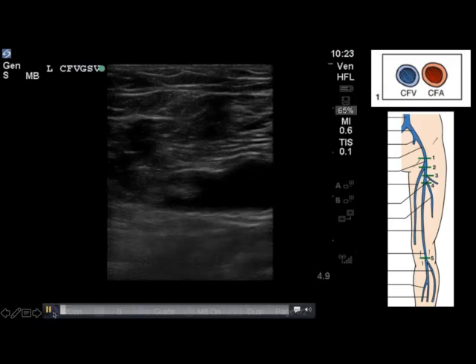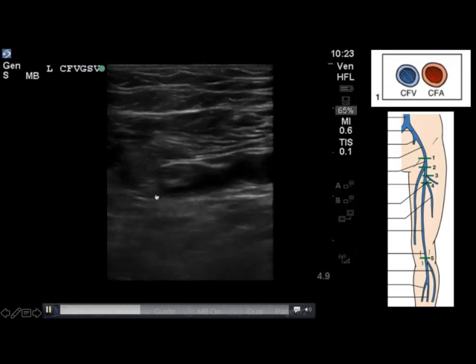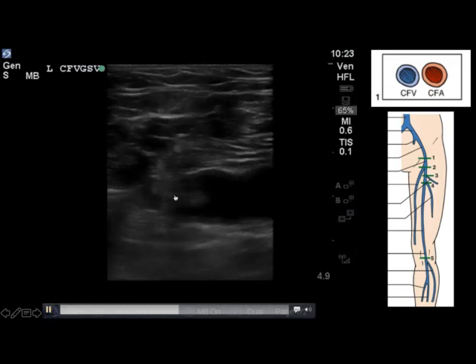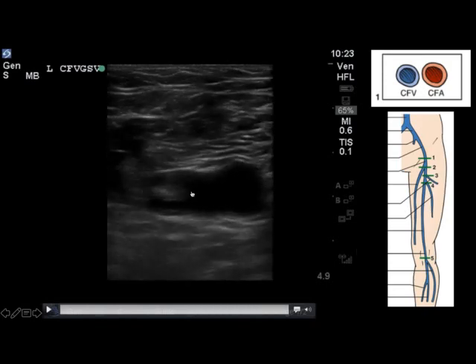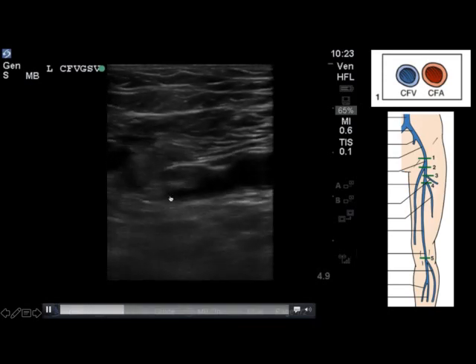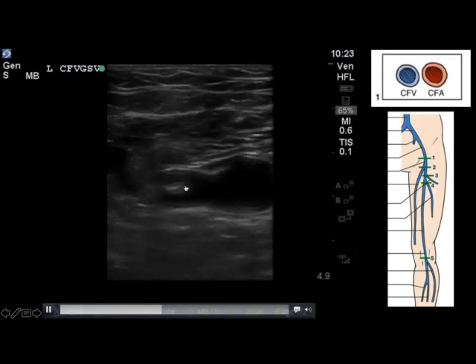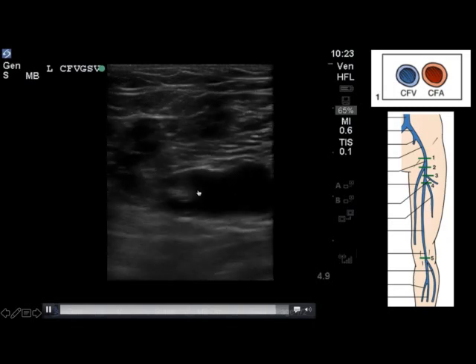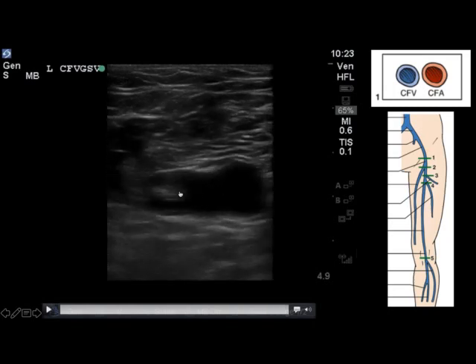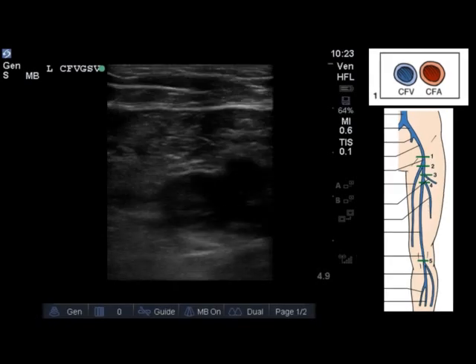You're able to see a little bit of echogenic material within the lumen of the vein even before compressing, but it becomes very apparent on attempted compression that we're unable to fully oppose the walls of the vein and that this echogenic material is indeed a deep venous thrombosis of this patient's left leg.